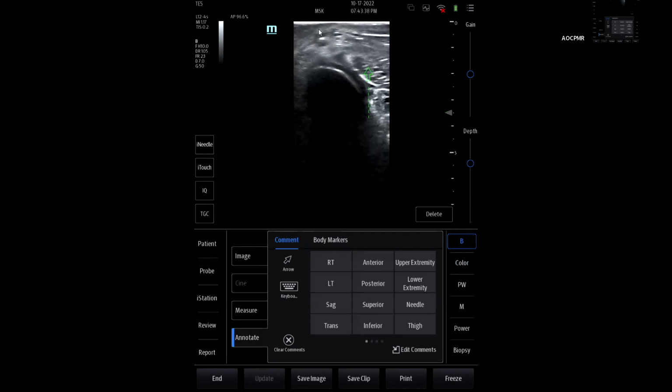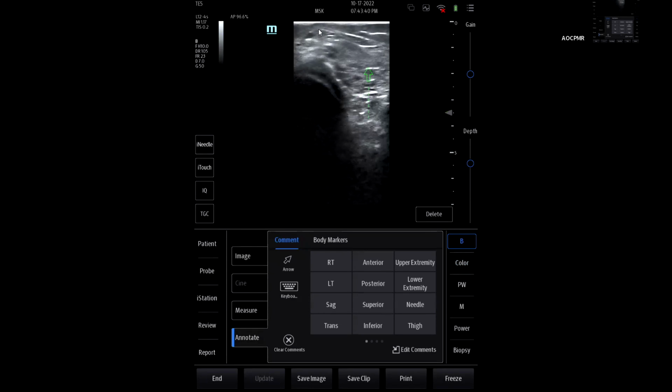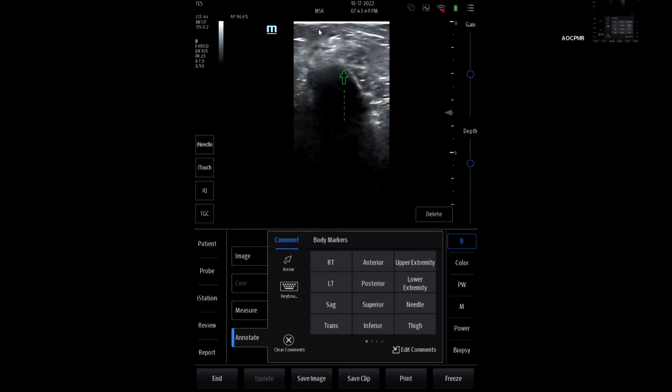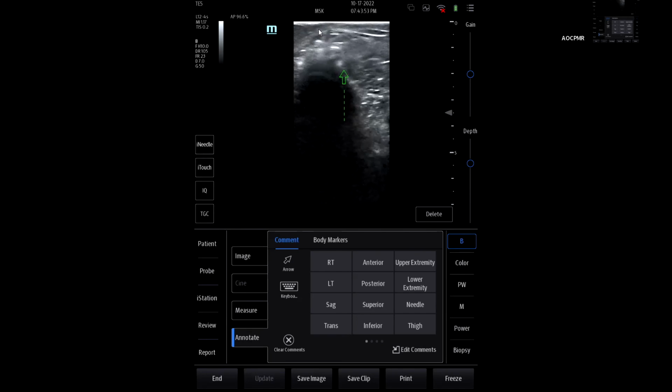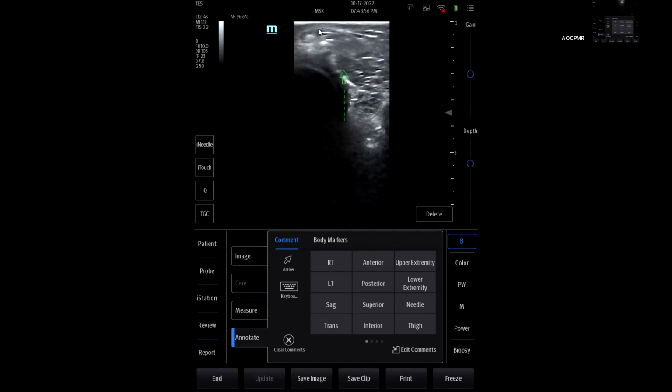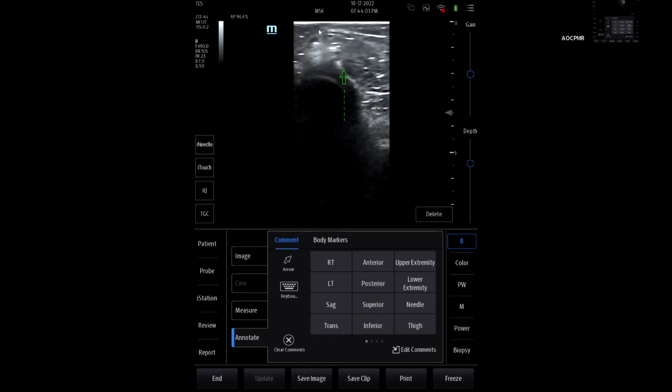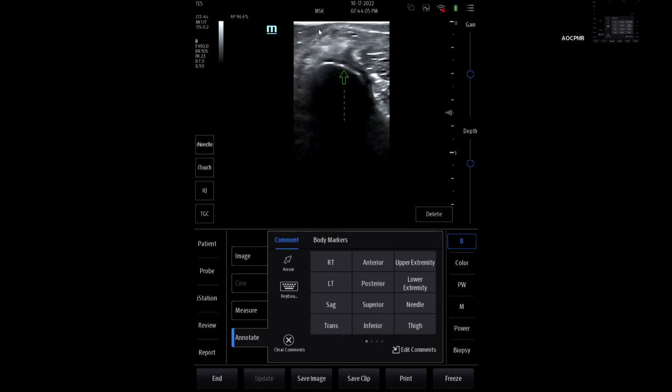This is all medial head, as it's going to slowly become tendon. And this is the semimembranosus coming down. So we're going to look for it in between these 2 structures, which I'm not seeing here. These tendons are very subject to anisotropy. So really be diligent, because if you're like this, you might think, oh my gosh, that's a Baker's cyst right there. But if you tilt your probe, nope, those are 2 very healthy tendons right there, 1 and 2. So you have to be very diligent with making sure you create a good image.